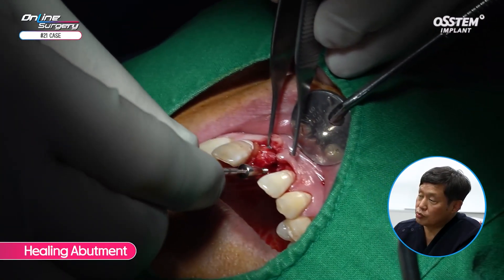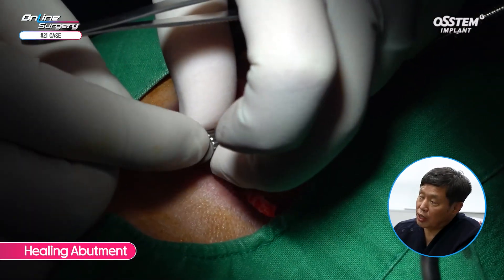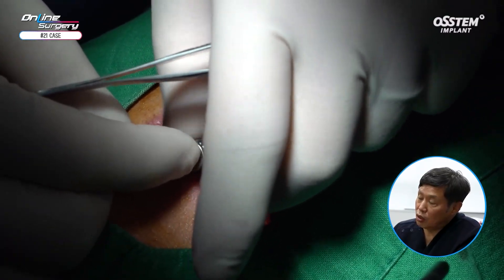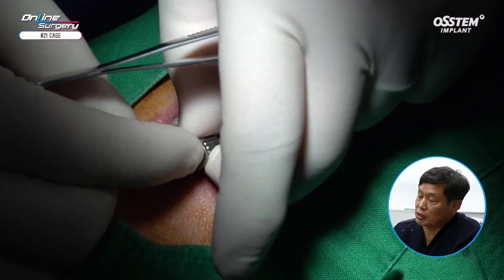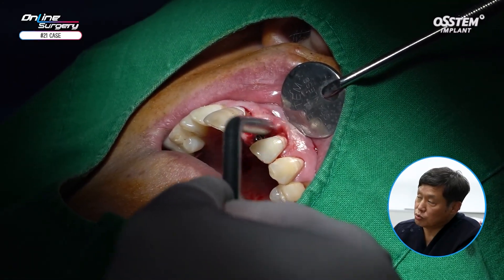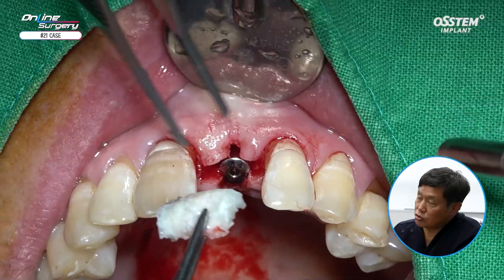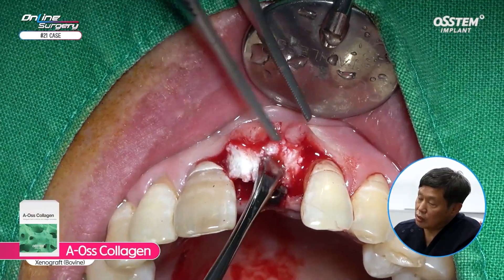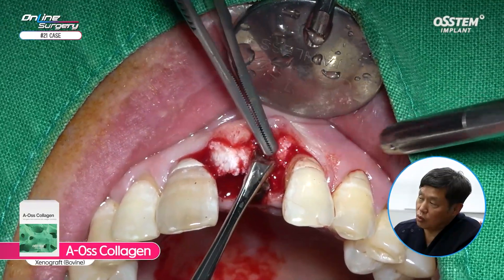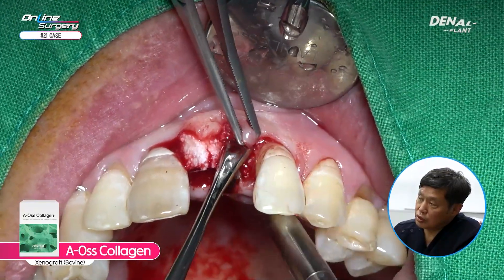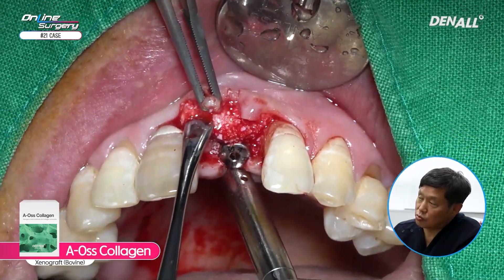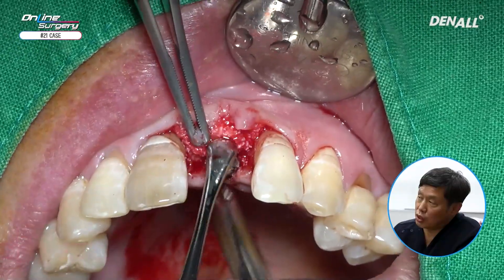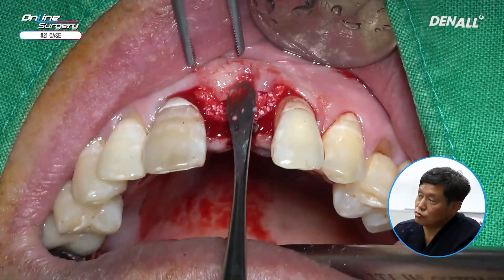We placed a healing abutment and added additional bone graft using AOS Collagen on the labial side. We also placed the abutment and took a CT scan for confirmation. The implant placement position appears to be good. As you can see on the labial side, I used AOS Collagen to sufficiently augment the buccal and labial areas of the implant. In order to prevent soft tissue shrinkage on the labial side, we performed a dual zone grafting technique, which supports both hard and soft tissues, using a sufficient amount of AOS Collagen for the bone grafting.